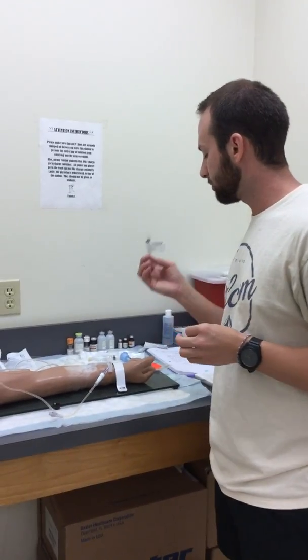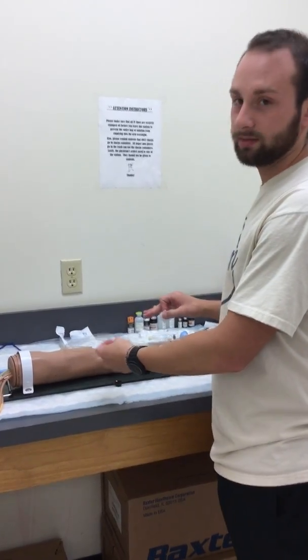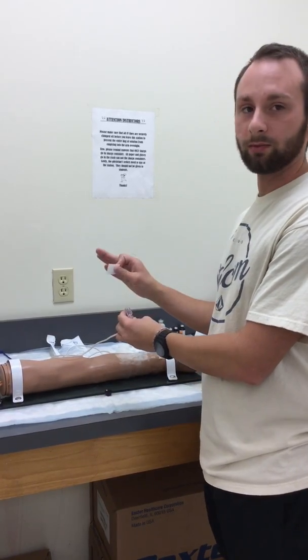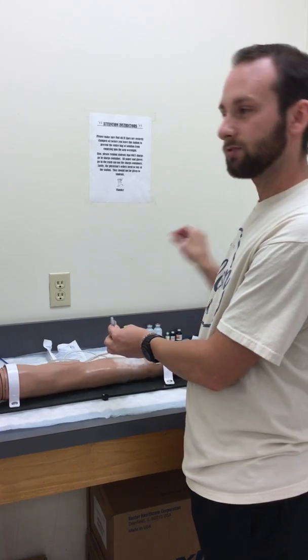Okay, we're going to do this push closest to the port first. We've already made sure that it's still patent and it's still good, so even though it is compatible, we're going to want to clamp so it doesn't flow back into the primary tubing. We're going to want to clean this with an alcohol swab while we have gloves on, but these do not fit my fingers.